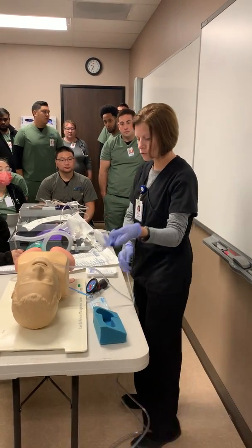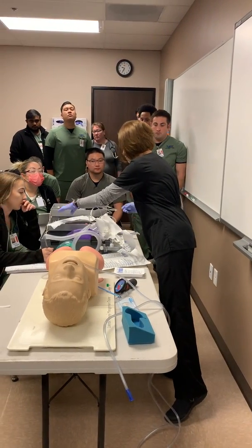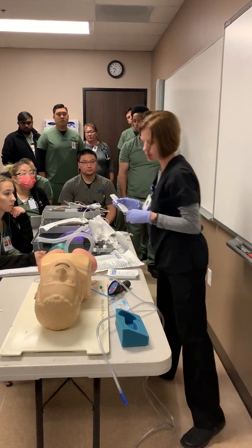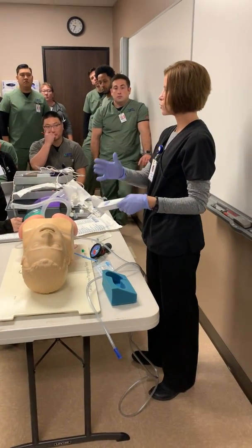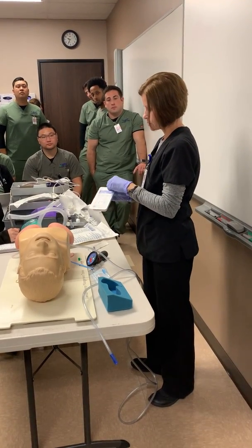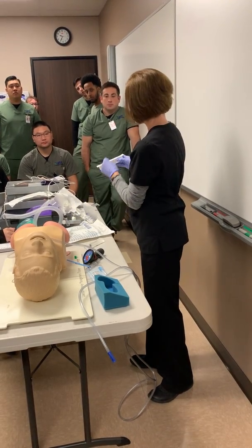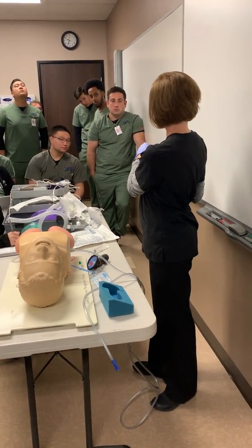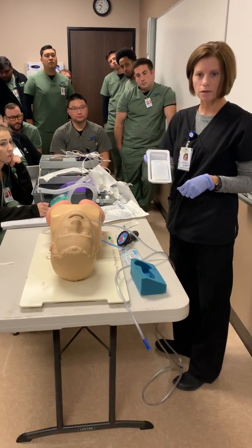Okay. I also want to make sure that I have some lubricant. We'll just pretend that this is it. So I've gone in, I've sat my patient up, and I've told them I'm here to help get some of the congestion out of their lungs. I'm going to open my packet, and when I do so, there's this little white area, and that's our sterile gloves. Okay, everybody see that?